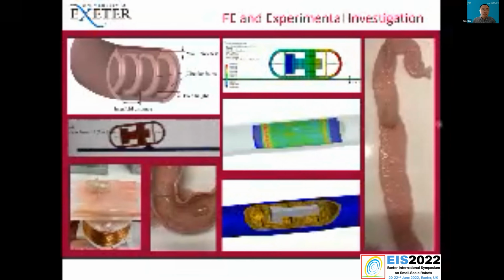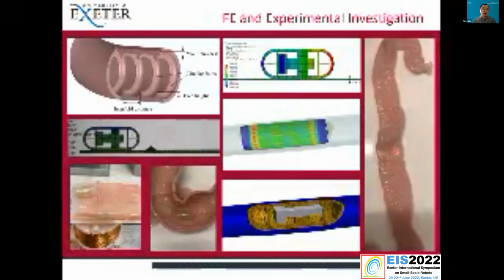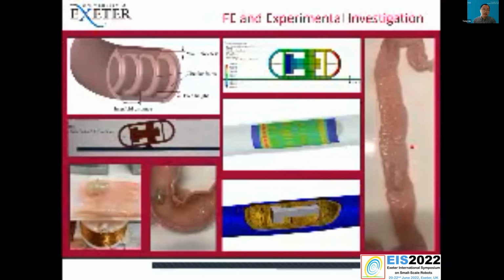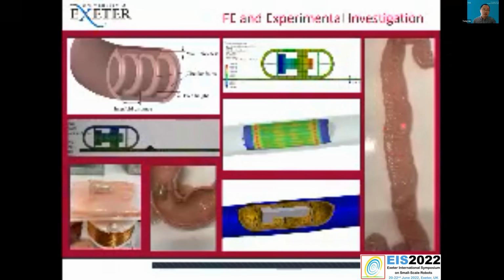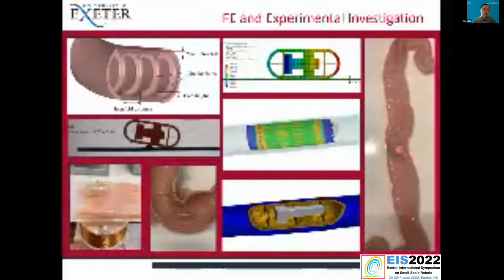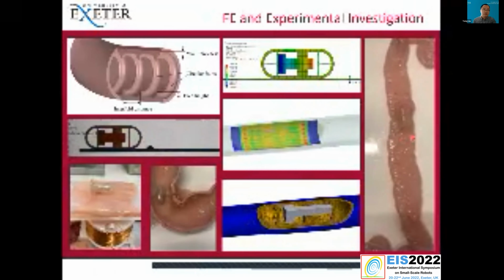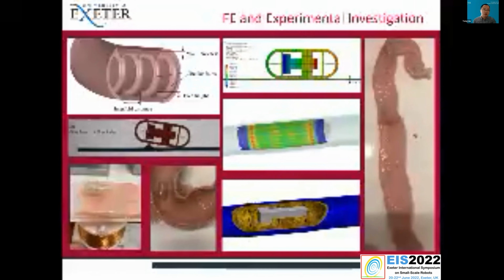And this is our ex vivo testing. We use a portion of small intestine, and we put our capsule in a fully surrounded intestine in this case. You can see we can drive it freely in the small intestine, and it is sufficient for progression in the small intestine.